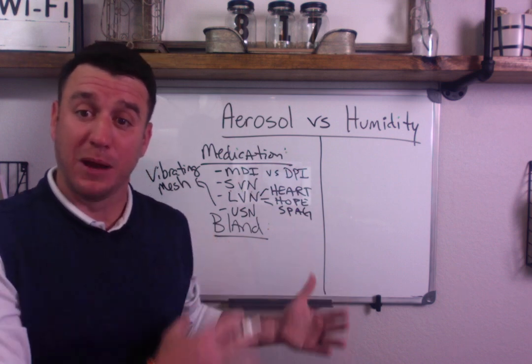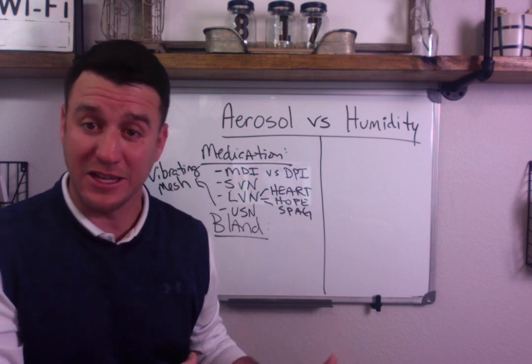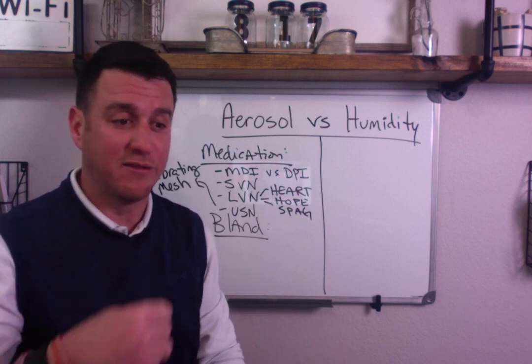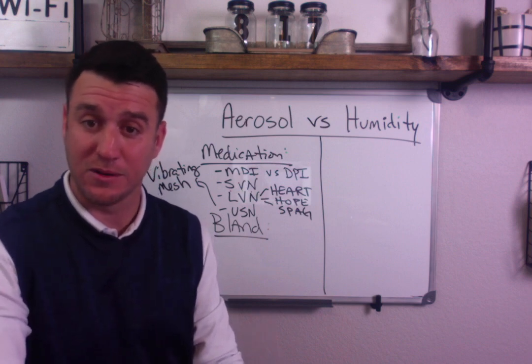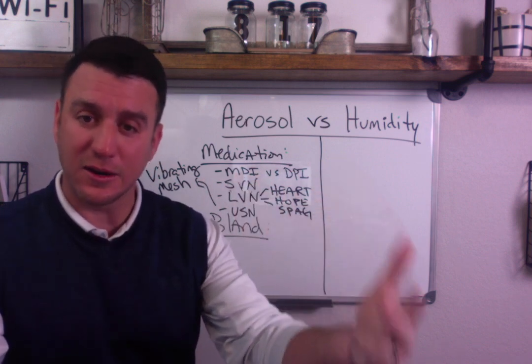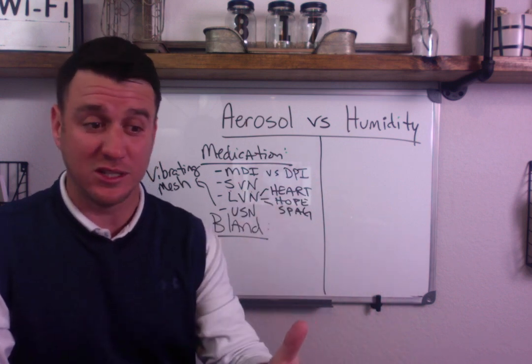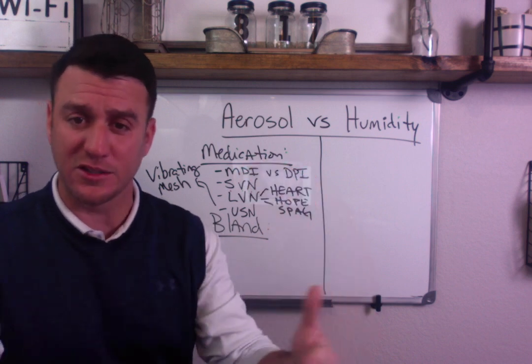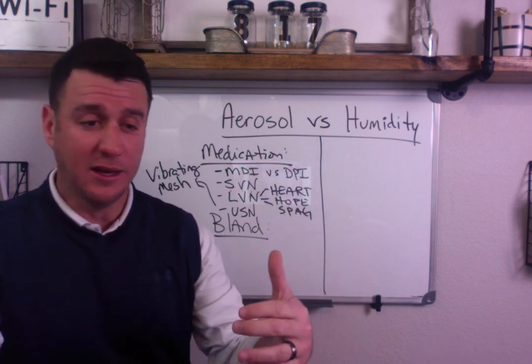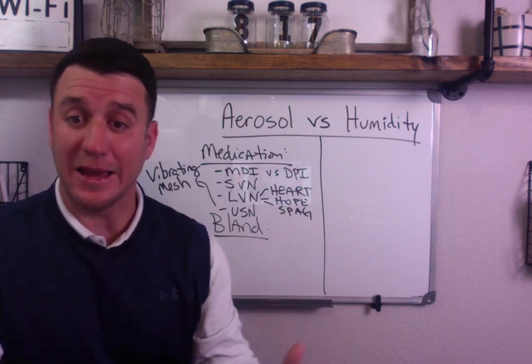We have to break it down to bland aerosol delivery. This is when we're not giving a medication, but we wish to deliver aerosol to our patient. Okay, this is when we're talking about trach collars, face tents, aerosol mask, things such as that. Okay, the patient has thick secretions and we want to give some aerosol to help mobilize and move those secretions. So we will give a bland aerosol.